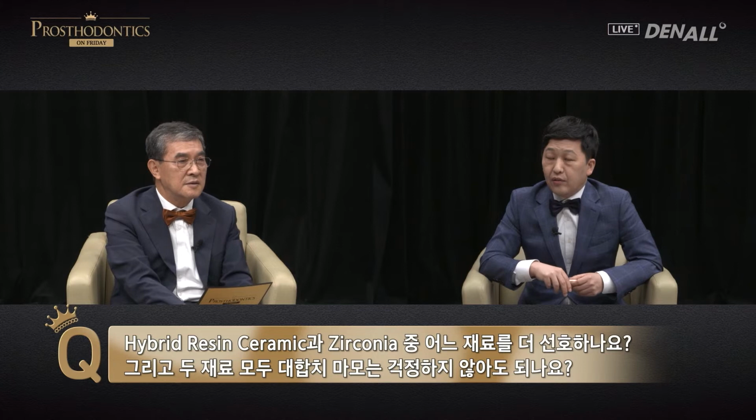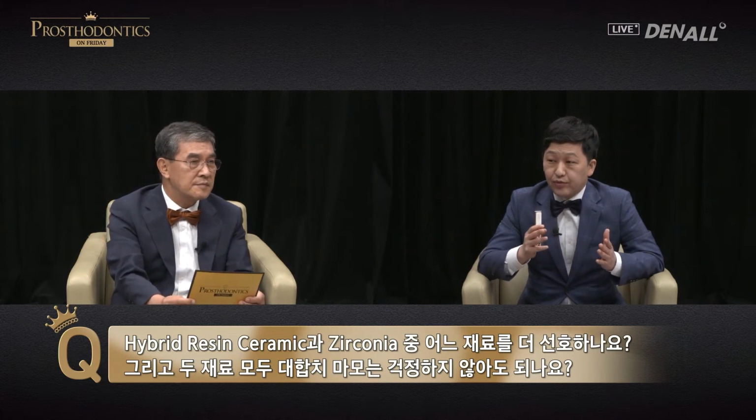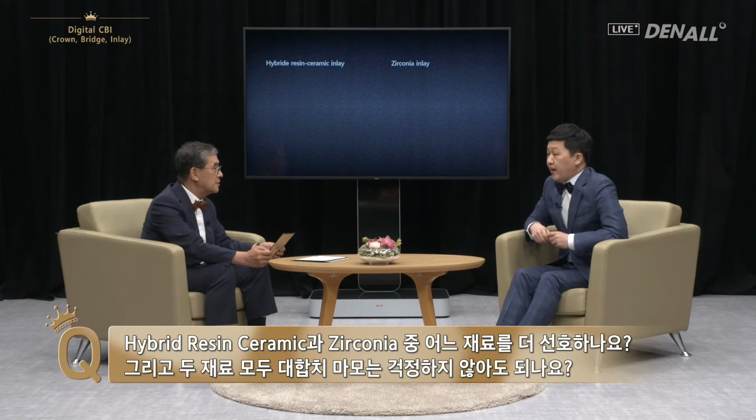I rarely did gold inlay or gold crown. The reason I don't do gold inlay is not only because of crack, but it takes approximately 4 to 5 days until prosthesis comes after impression is taken. The main reason I use hybrid resin ceramic for inlay using digital technology is because I can complete restoration within 1 hour on the same day. That's why I don't do zirconia inlay, and I have summarized the reasons.